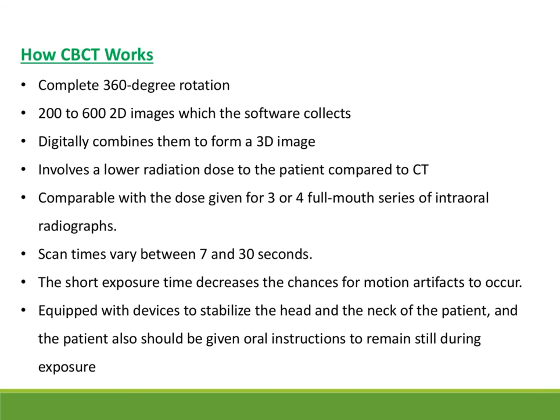200 to 600 2D images are taken with a single exposure. They will combine to make a 3D image. So, why do we advise CBCT? Because it has a lower radiation dose than CT.